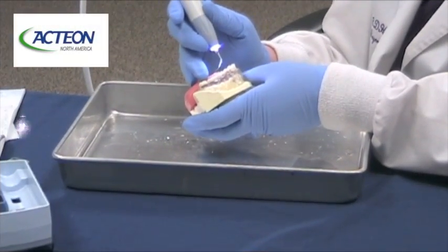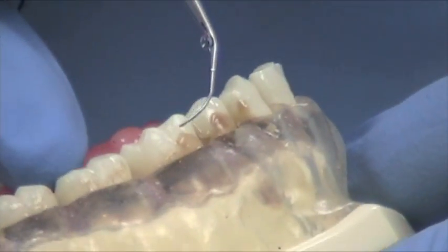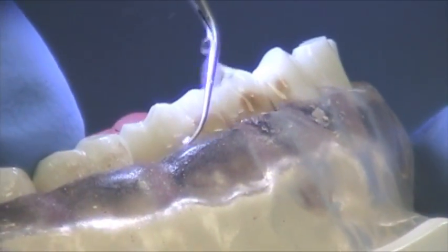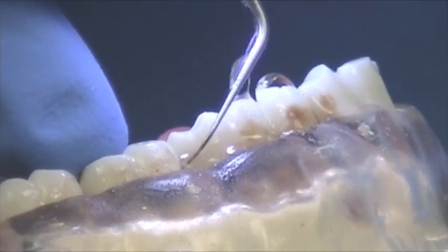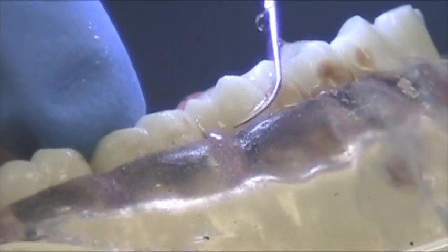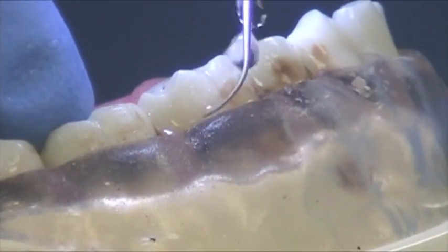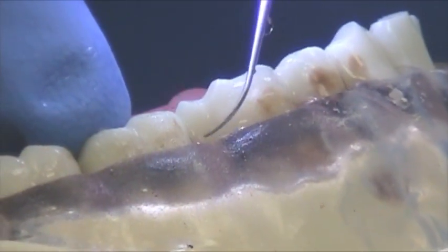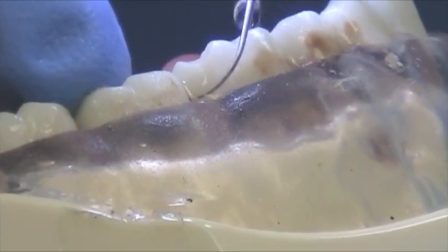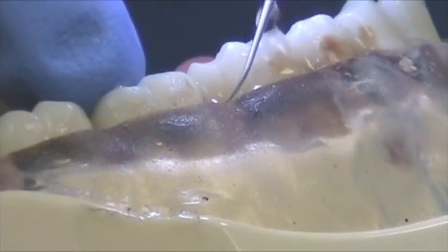Next we're going to talk about the P2R tip, and like the P2L, it's used in the green mode or the low power. It kind of makes sense when you're looking at your tips to see how this would be in the low power, because it's so tiny and so fragile — but see how it just wraps around the distal there. Taking out grainy calculus and biofilm. Notice the drop-by-drop irrigation; you're not drowning your patient. Notice how quiet it is, how slow and systematic. This concludes the set of the P2R and the P2L.